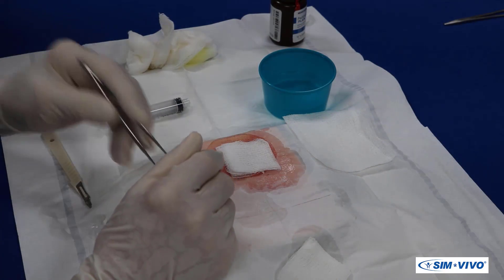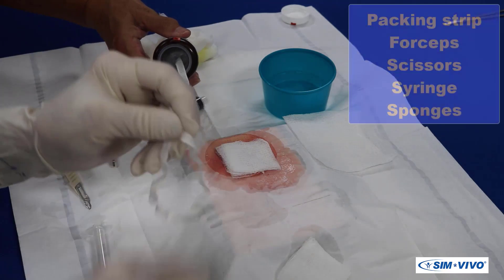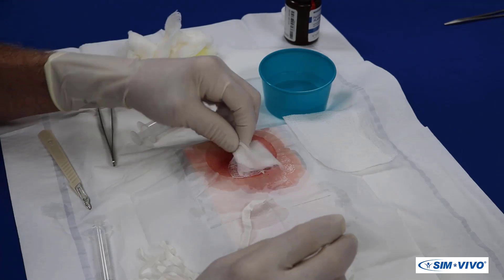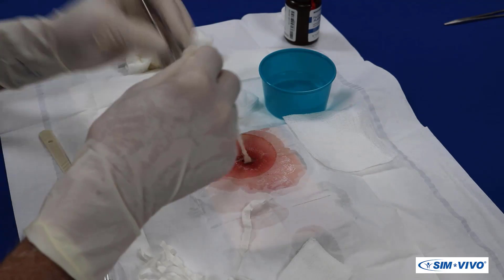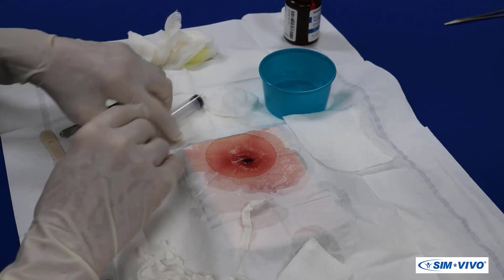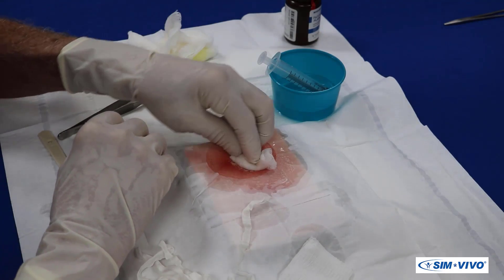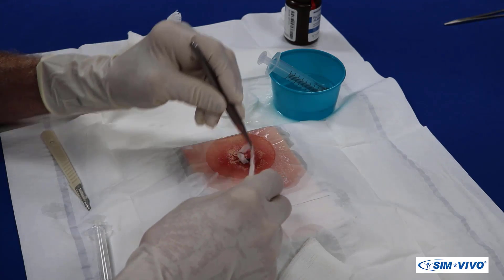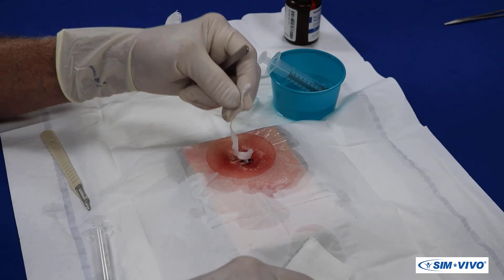A continuation of this scenario will demonstrate the continuing care after an incision and drainage, which will require packing removal and replacement. The only necessary supplies are a length of packing strip along with forceps, scissors, a syringe, and sponges. Expose the abscess and remove the previously placed packing with the forceps. Irrigation can be performed if you believe it will be beneficial. Grasp the end of the packing strip and place it into the abscess cavity as before. Do not pack the cavity too tightly, as the goal is for the cavity to heal from the inside out.